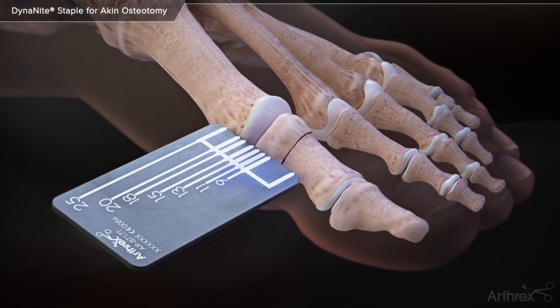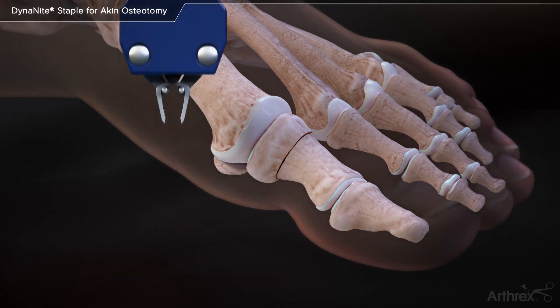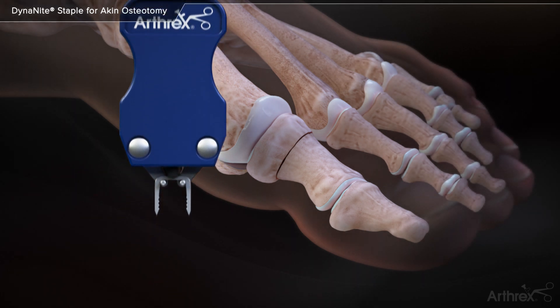The Dynanite Sizing Guide is used to determine the correct Dynanite staple size. Turning the inserter handle clockwise, the Dynanite staple legs are opened from an inward position to a parallel position.